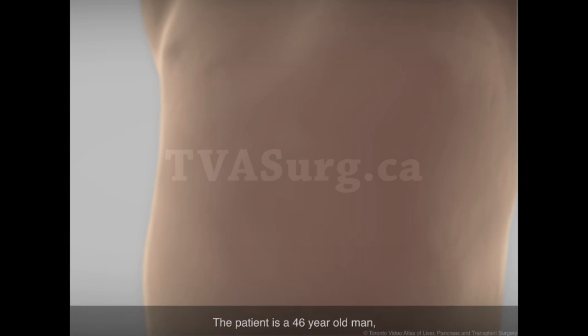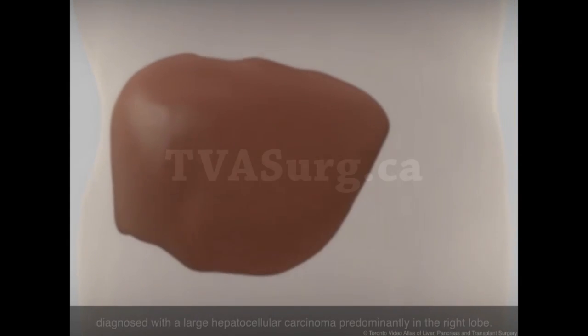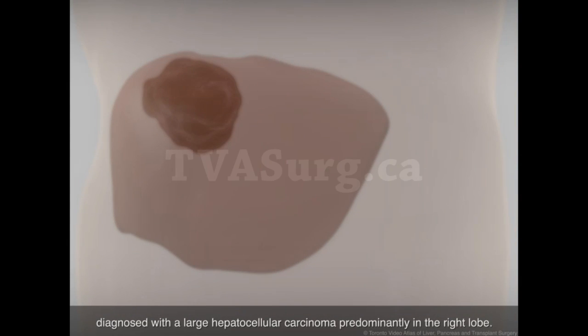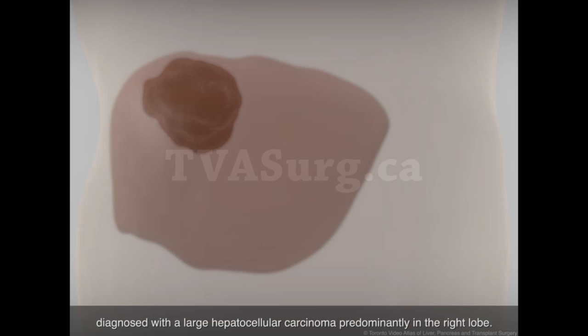The patient is a 46-year-old man diagnosed with a large hepatocellular carcinoma, predominantly in the right lobe.